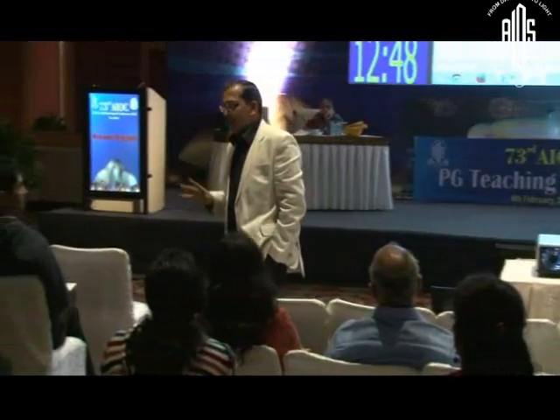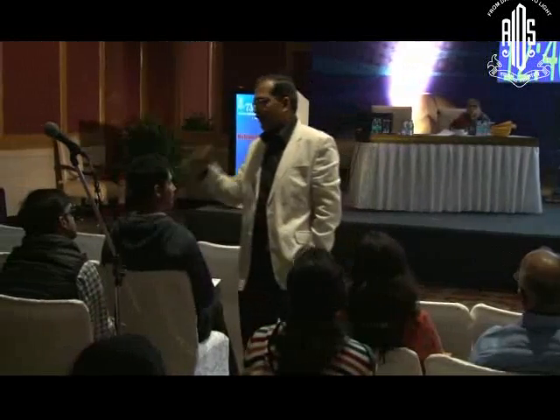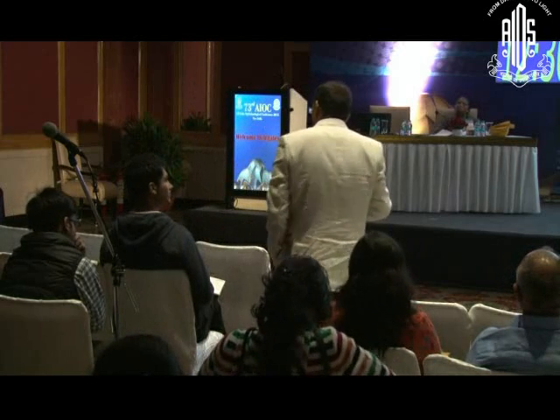0 to 7 diopters, no change required. You can just put it in the sulcus or in the bag. 7 to 17 is 0.5. 17 to 27 will be plus 1. This man, if you put just 0.5 correction, still he will have a myopic shift. So after 27, it will be plus 1.5. You have to reduce 1.5. So the more the dioptric power of the lens, the more you need to subtract. You understand? So this is how it is.